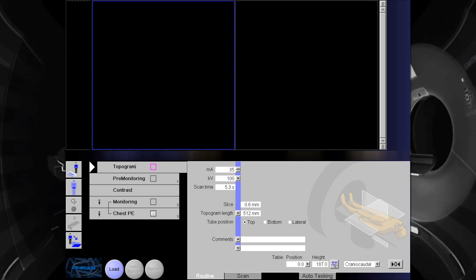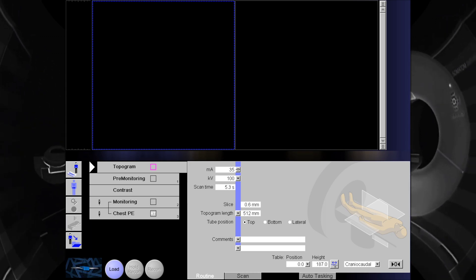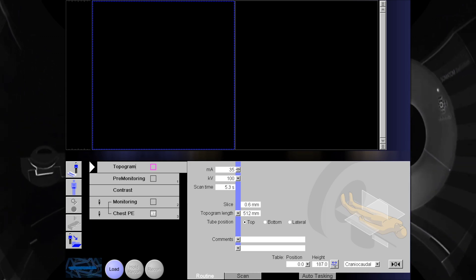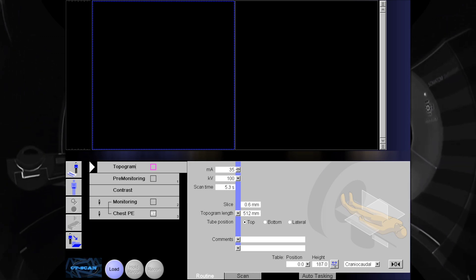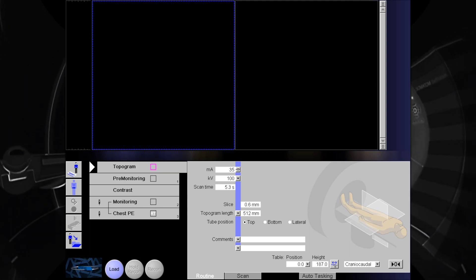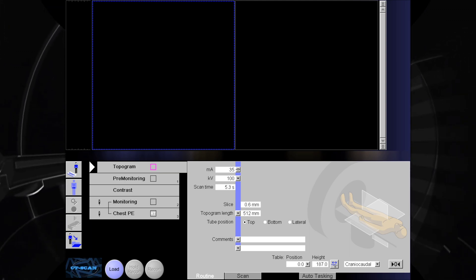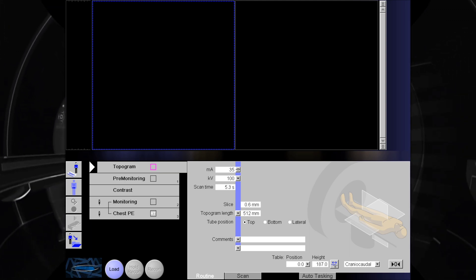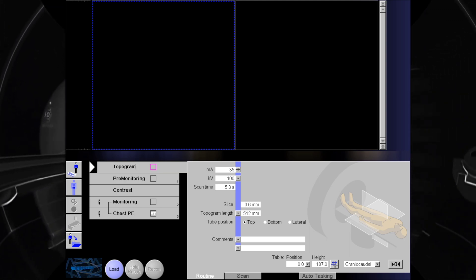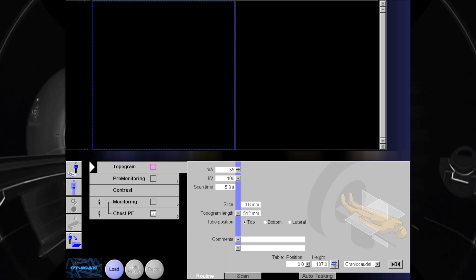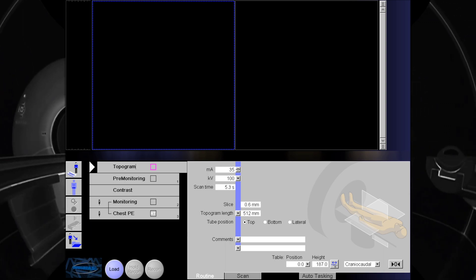Hi, welcome to my CityScan tutorial. Today, I am going to show how to do City Chest Pulmonary Angiogram using bolus tracking technique.